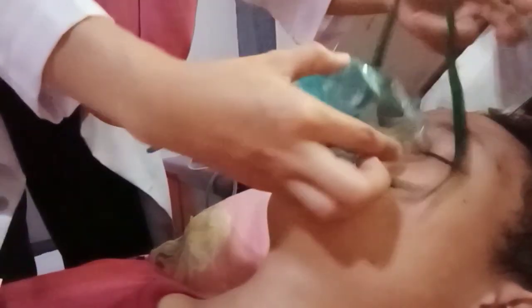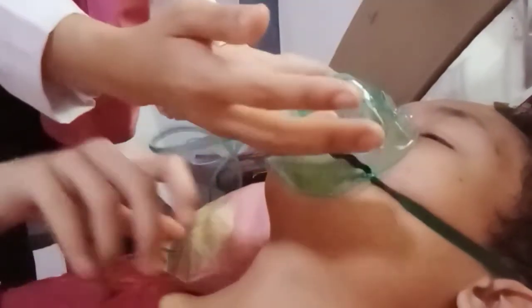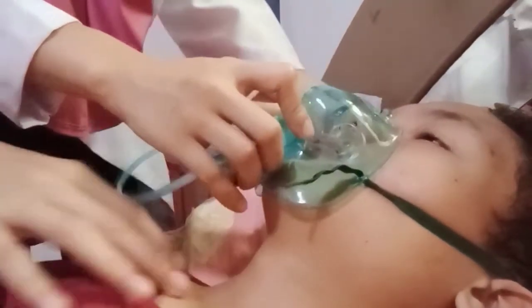A loose or poorly fitting mask will result in oxygen loss and decreased therapeutic value. A mask may cause a feeling of suffocation, and the patient needs frequent attention and reassurance.